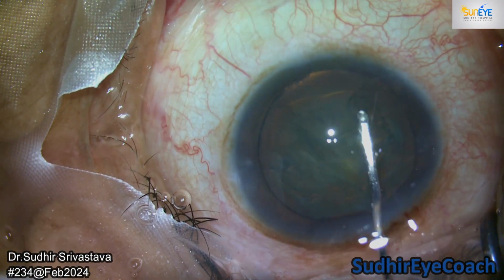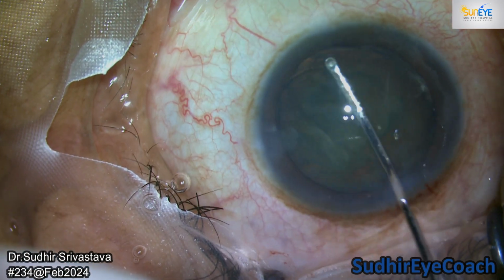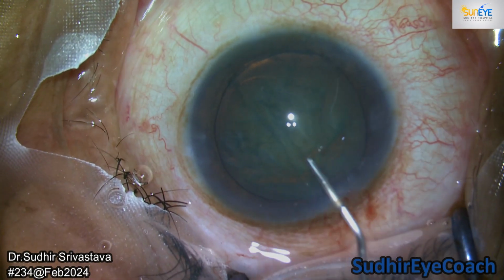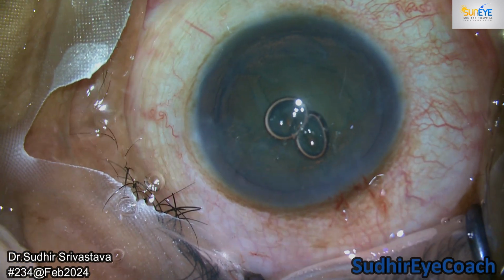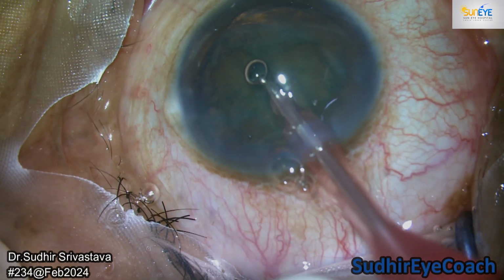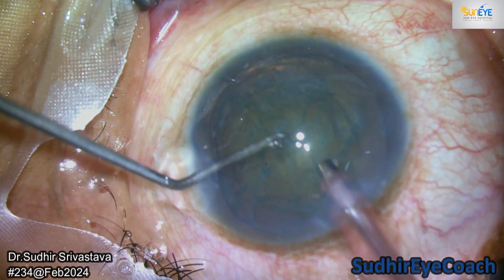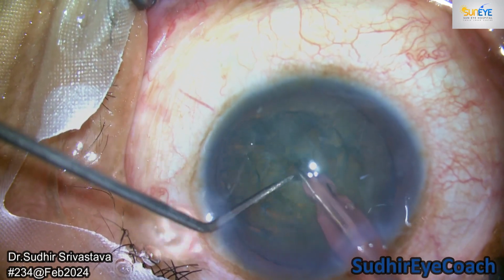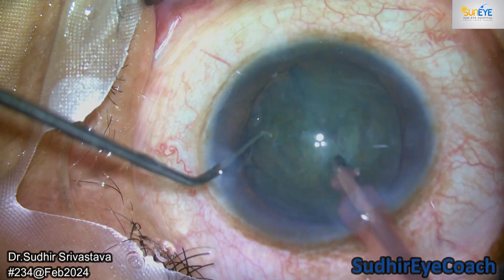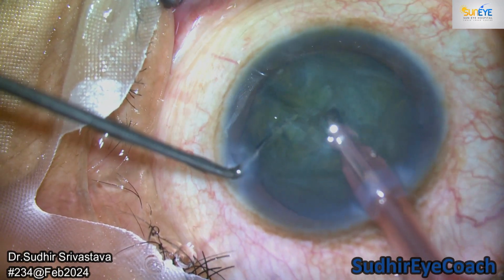Do gentle hydro procedures but rigorous, meaning you should perform them gently, but you have to be sure that your nucleus is separate and your capsular bag is separate from the cortical matter. I use low intraocular pressure in such cases. You can see the movement of the whole capsule, because the zonules are weaker in quite a big area.